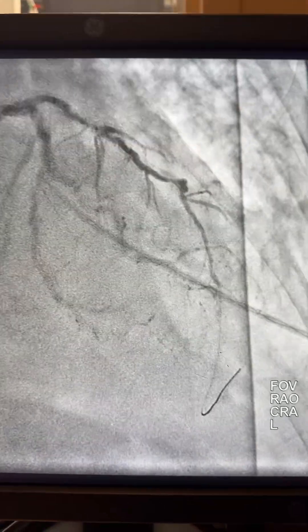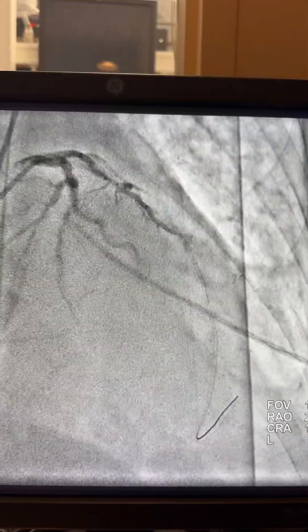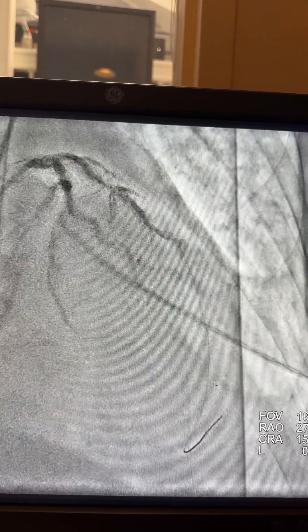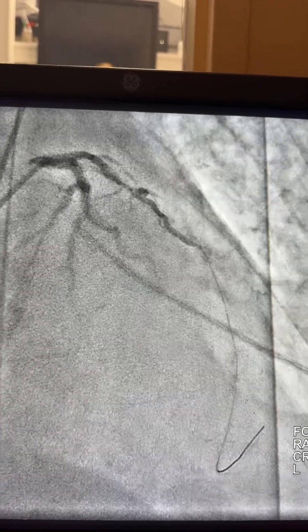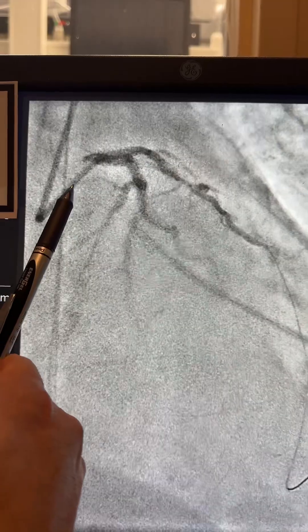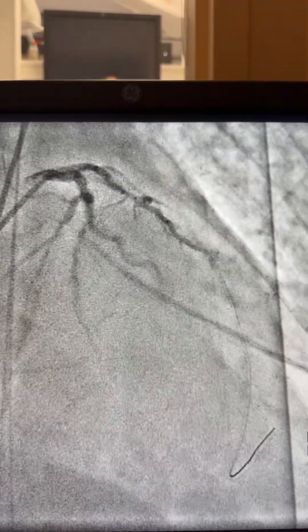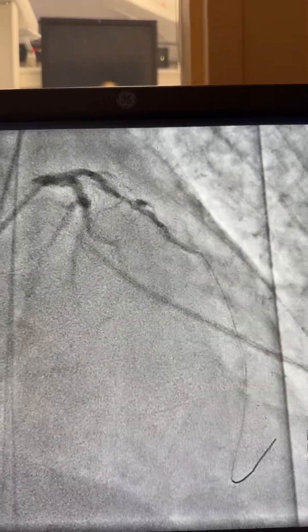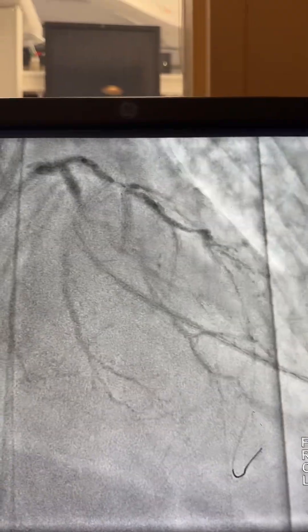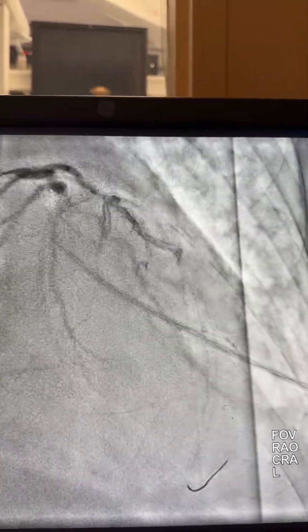I'm going to work on the right cranial view as usual. I will use good support from the guide catheter, which is XP 3.5, and we have a guide liner. Of course, you won't advance the guide liner until you advance the balloon. Here is the lesion — almost occlusive, 95-99%, heavily calcified. The wire is running through to the landing zone well distally.